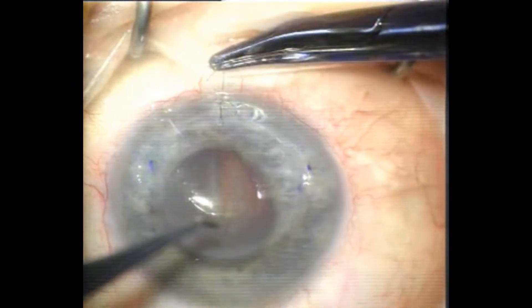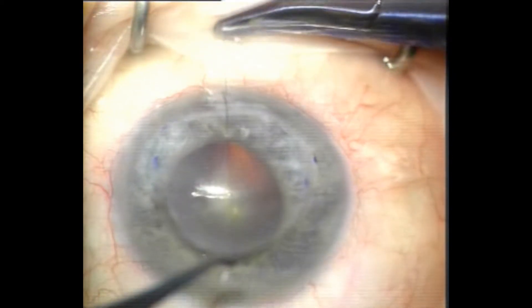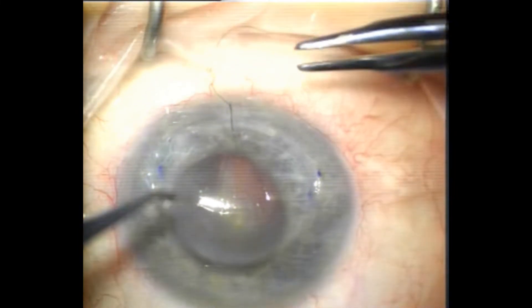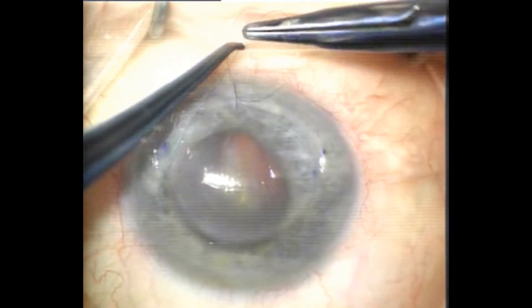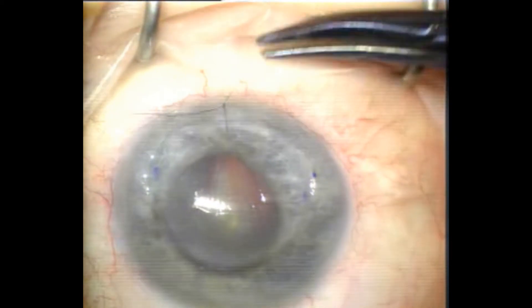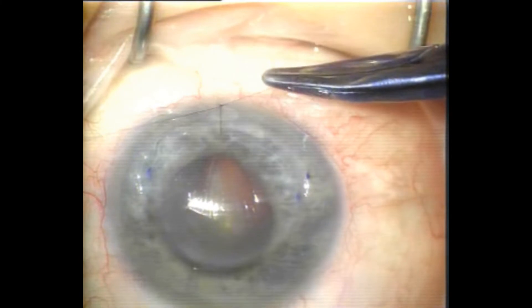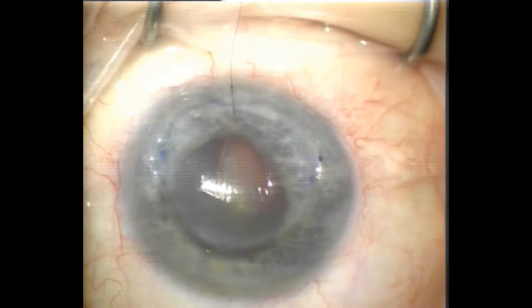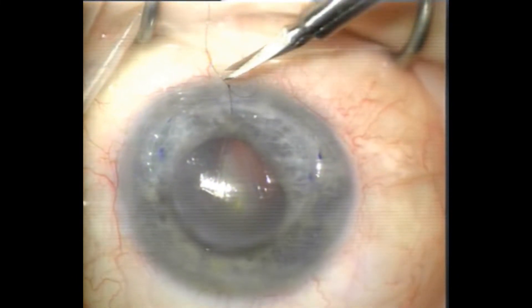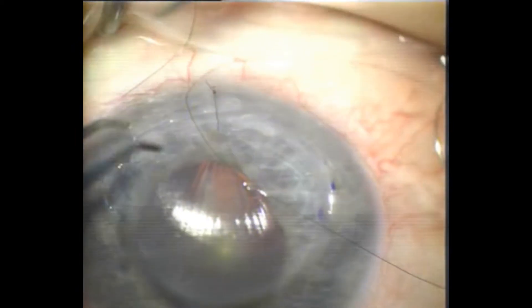At the end of the case you'll see that this suture is actually relatively loose and I've replaced it, but pulling it fairly tight initially. I'm using a 1-1-1-1 with a slip knot — that's easy to adjust the tension in this situation and it leaves you with quite a small knot.